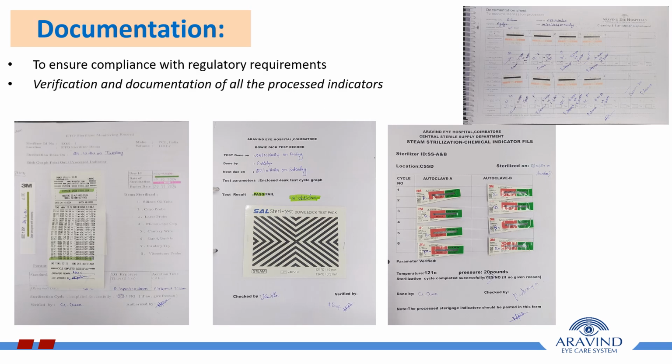So, documentation. To ensure compliance with regulatory requirements, all the processed indicators should be verified by the senior staff and then documented in the relevant registers.